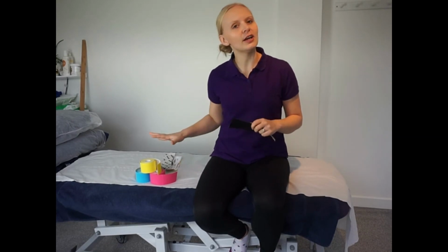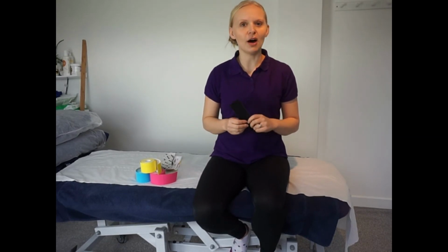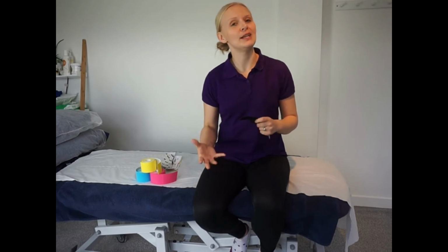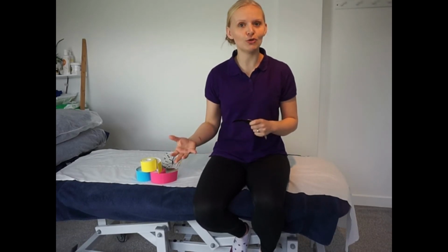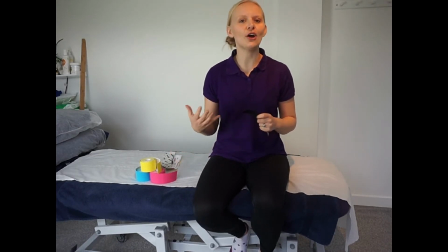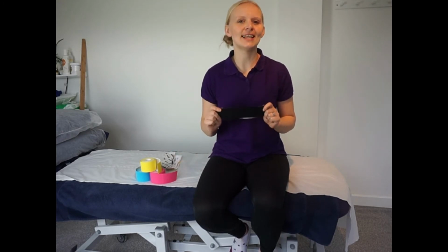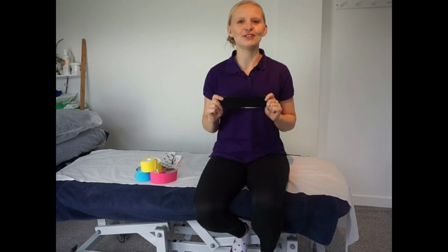If you buy the tape at the lower end of the market, yes, it's going to be more cost effective for you, but really, is it going to make that much of a difference for your clients? Probably not. You don't want your client to get home from your treatment and that tape is already peeling off their skin. So always invest in good quality tape because it lasts a lot longer and gives your clients better results.